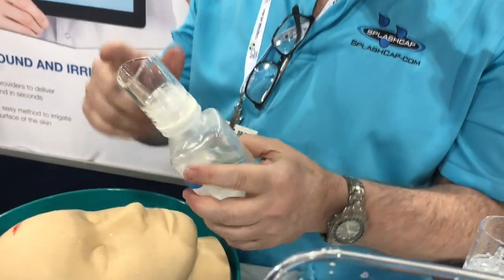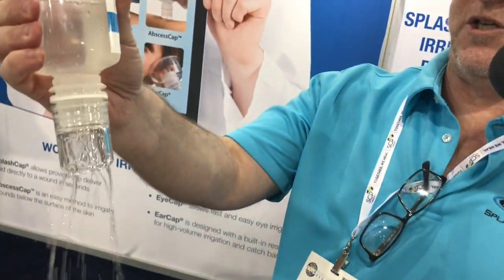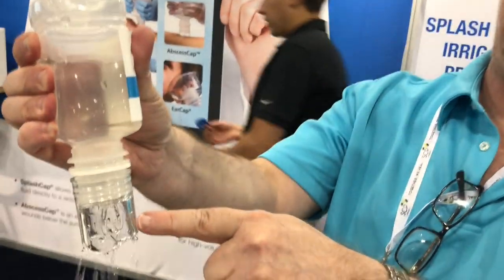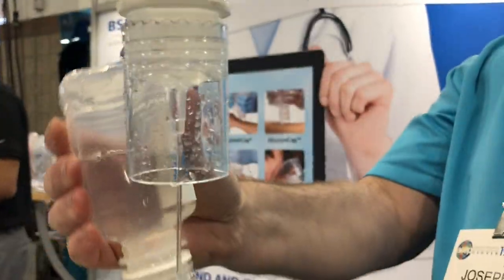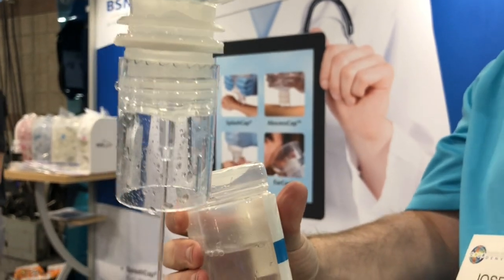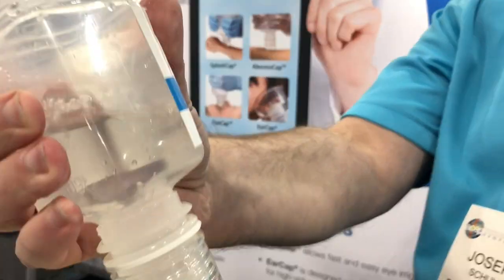You can see here that it's got a different rim and a different kind of nozzle. The spray goes outward — there's no direct pressure on the eye — whereas the splash cap had a single nozzle with high pressure; this is going to be no pressure because it goes all out to the side and then trickles down.